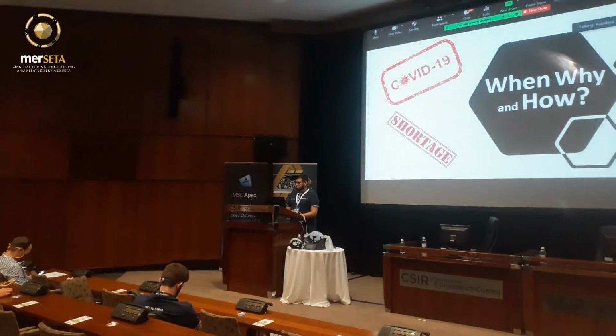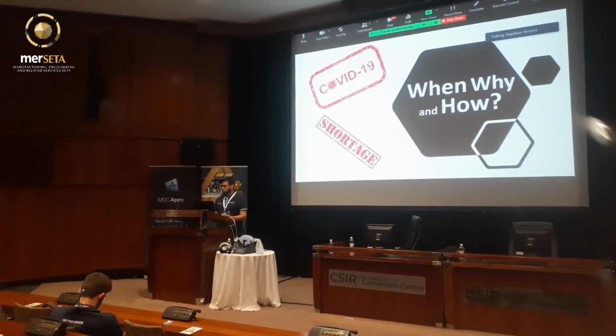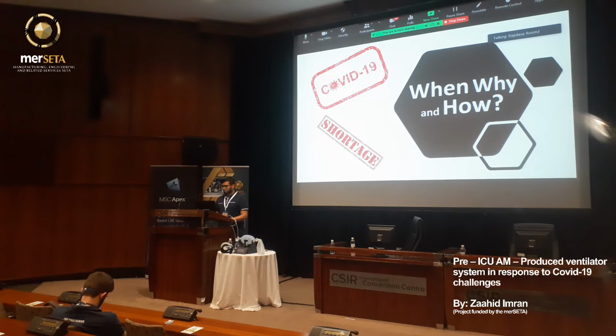So, an early challenge for the first responders of the COVID-19 epidemic was the availability of CPAP and BiPAP machines that were portable and easy to implement en route to the ICU. In response to the shortage of ventilators in the early stages of the pandemic, the need for design of a low-cost portable ventilator that automatically inflates and deflates the ambibag as per the requirements was initiated.